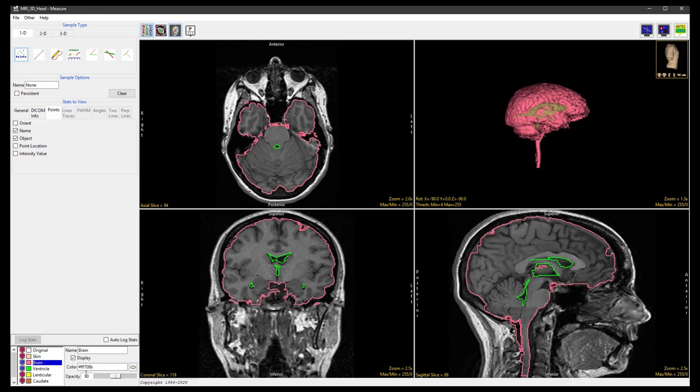We can also reduce the opacity of the brain object to 10% so we can clearly see the ventricle object in the rendering.